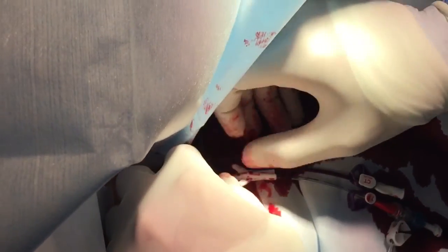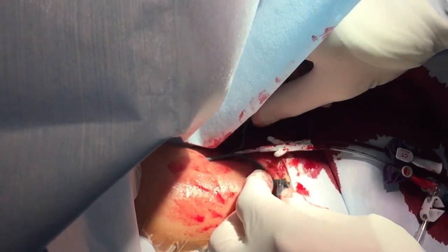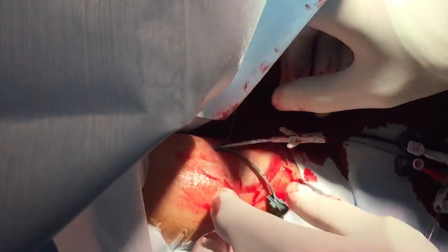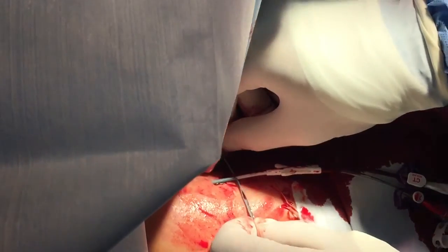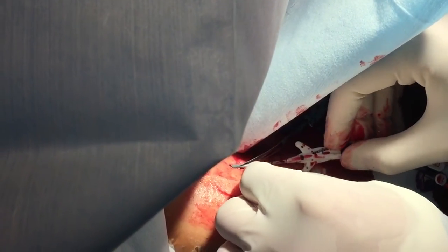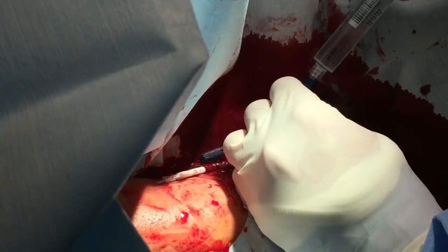Don't break it inside the skin. Break it outside along the actual midline itself. Break. Not to the skin. There we go. We stop. We pull back. And break. Pull back. And this will be the final pull. It's now fully split. We can advance the midline to the hub.